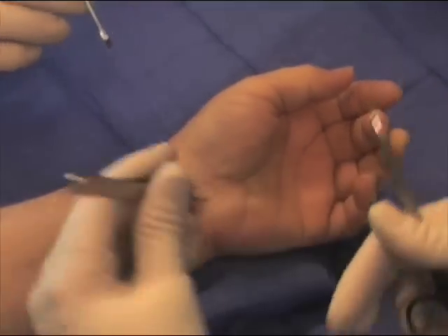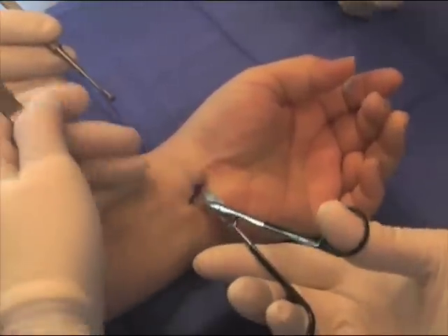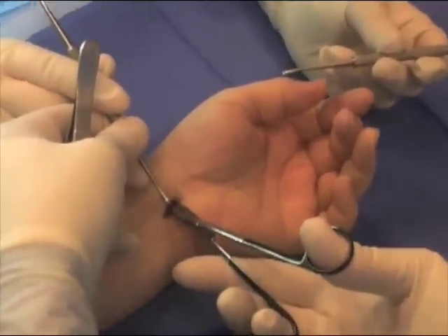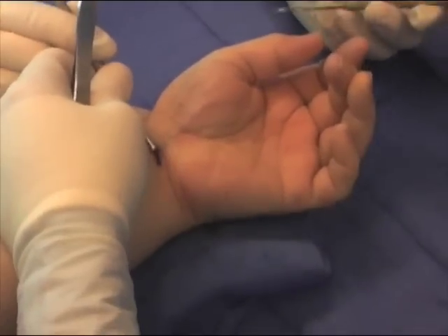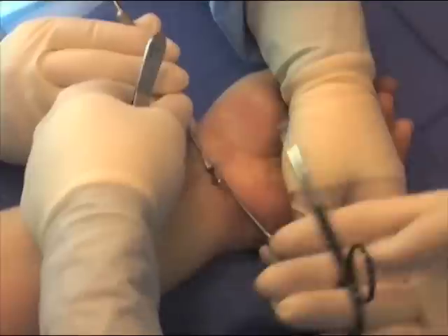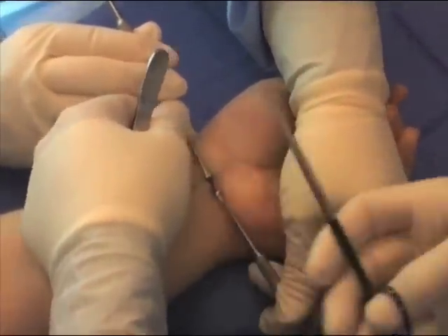The small quarter-inch incision is made, taking care to only cut the skin and none of the underlying structures. The patient is under sedation and is given local anesthesia to prevent any discomfort during the procedure.